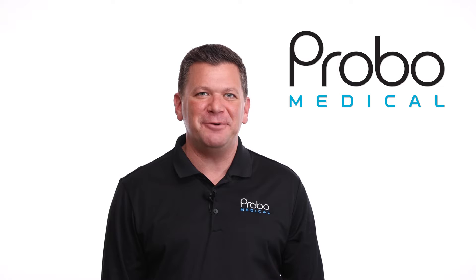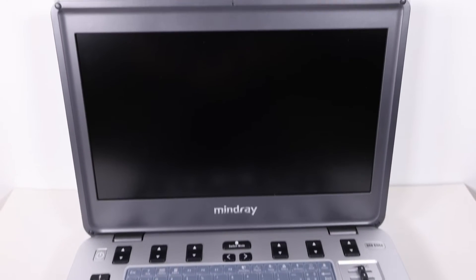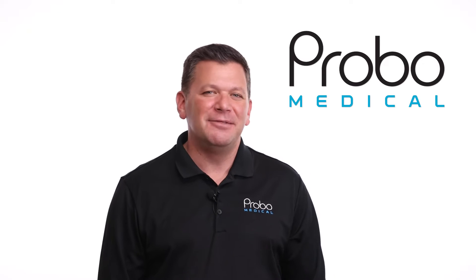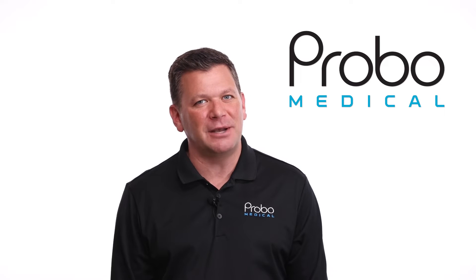Hi, I'm Brian Gill with Probo Medical, and today we're looking at the Mindray M8 Elite portable ultrasound machine. In our testing we found many things to love about the Mindray M8 Elite, and it truly does a great job as a full-featured portable ultrasound machine.